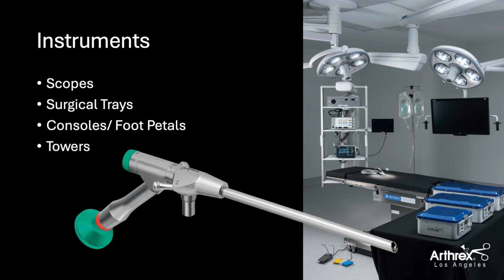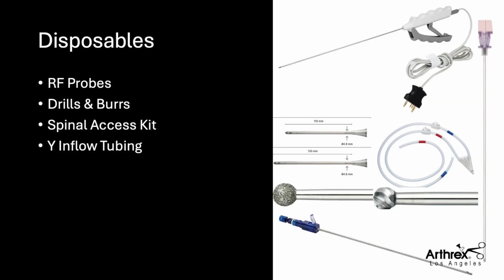Sometimes if we don't have a tower specifically in the account or we're using another company's video, we want to make sure that we have extra energy cords, or electrical cords specifically, that will be into the device, into the wall, because sometimes it's not within their current tower.